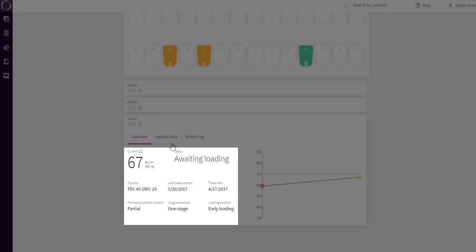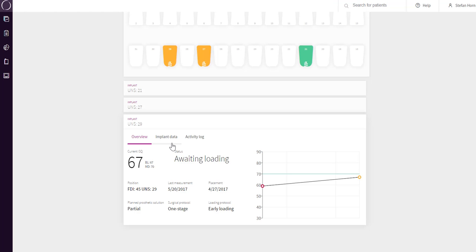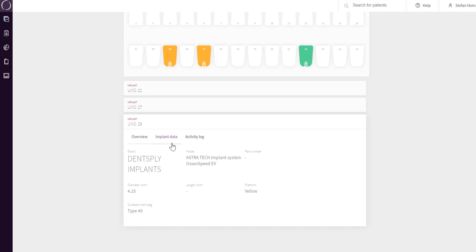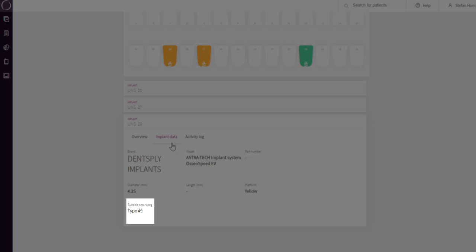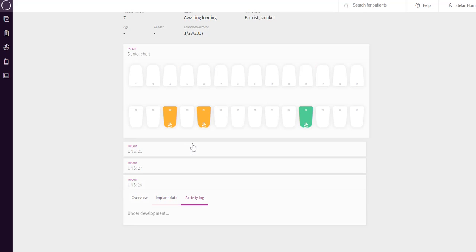The Overview tab will show available data for the specific implant. The graph to the right will show all ISQ measurements performed, color-coded according to the ISQ scale as a view of the stability trend. The Implant Data tab will show available data of the implant placed and the SmartPak type to be used. The Activity Log tab will show all activities performed during the implant treatment period for each position. This information is under development and therefore not available yet.